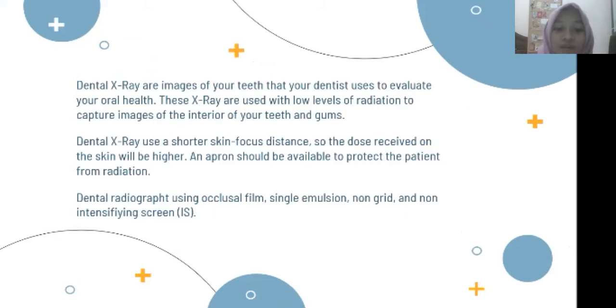Dental radiography uses occlusal film, single emulsion, non-grid, and non-intensifying screen or IS. So, dental X-ray can help your dentist to identify problems like cavities, tooth decay, and impacted teeth. Dental X-rays may seem complex, but they are actually very common tools that are just as important as your teeth cleanings.